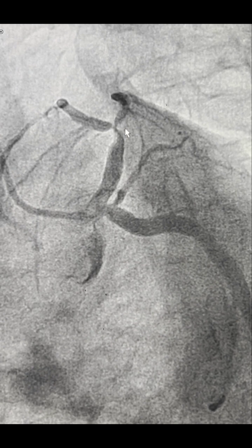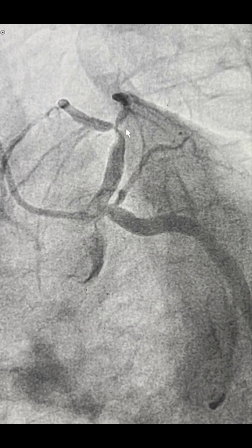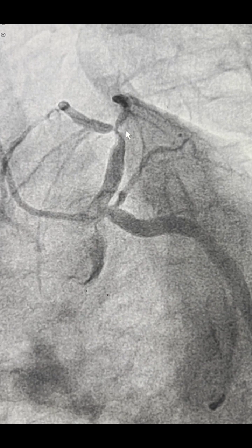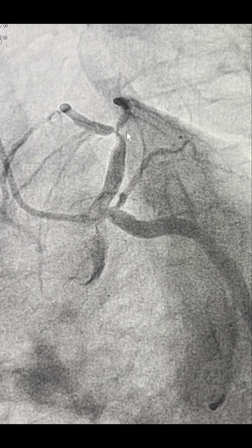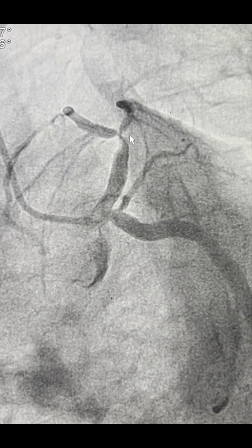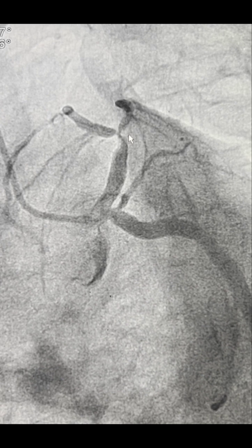in this case. You can see how the Tiger catheter was hanging in this short left main, and near the arrow in this still frame you can see a very tight thrombotic lesion in the proximal LAD, and across the diagonal you can see the ostium of the diagonal near the arrow. This is diagonal 1, and it also has thrombus. So it was difficult, and we anticipated the slow flow, no flow phenomenon in this patient because you can see the load of thrombus, and he presented within 2 hours.